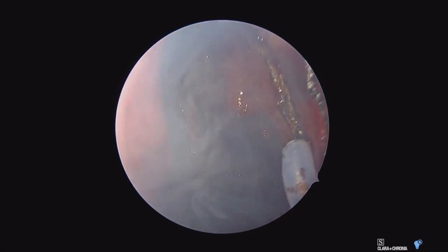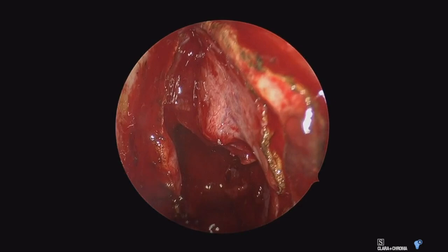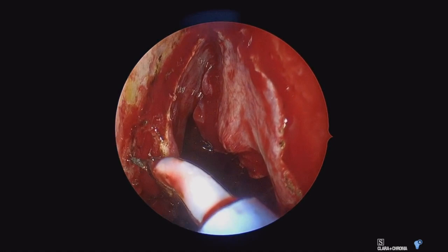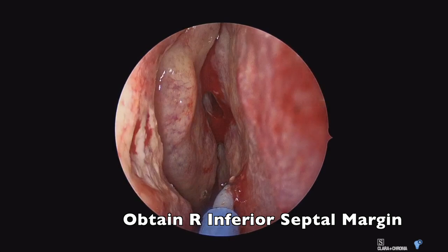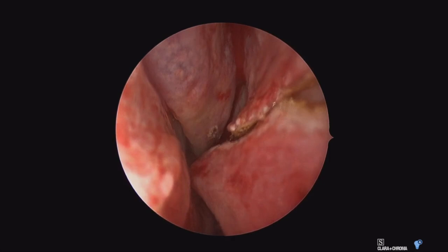Obtaining and tracking the margins on the intranasal side is a very important part of this surgery. Here we are marking the contralateral side and making corresponding incisions in the patient's right nasal cavity. We'll make our incisions, take out that septum, and then mark out and take our right-sided margins as well.